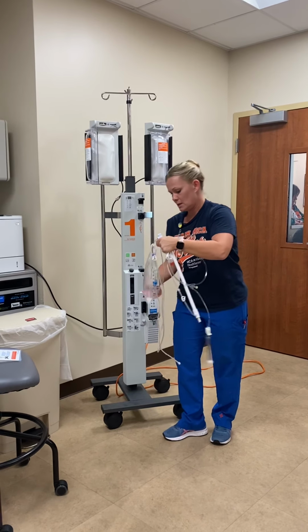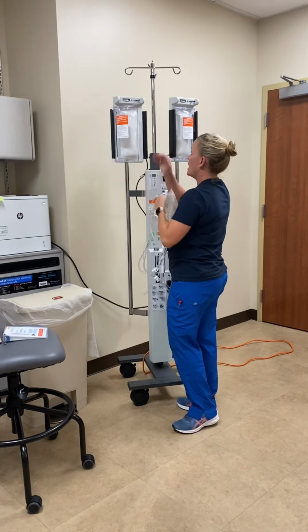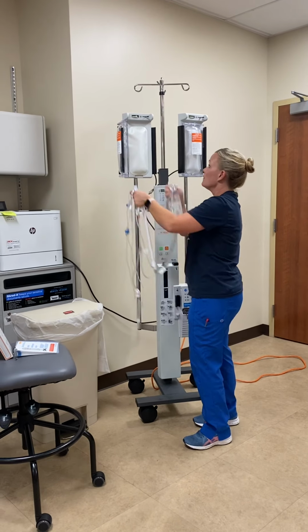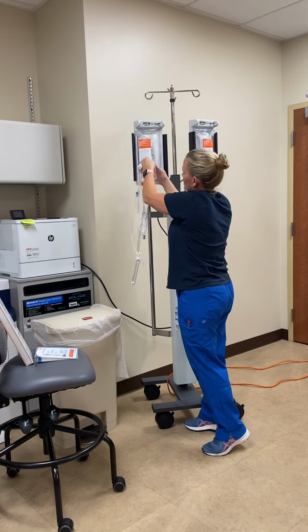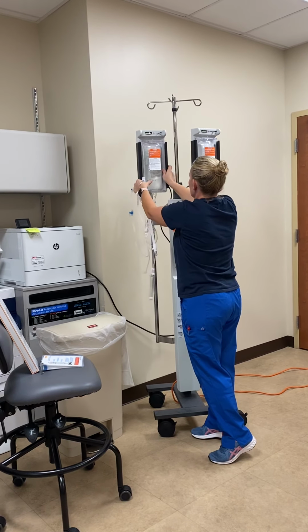Okay, so once you get that hooked up, you can go ahead and open this up. For those of you that don't know how to open this up, it's simple. You just pull this black thing back and it pops open for you. Your blood, you can probably hang on a smaller hook. There's different size hooks in here for whatever size bag you're gonna use.